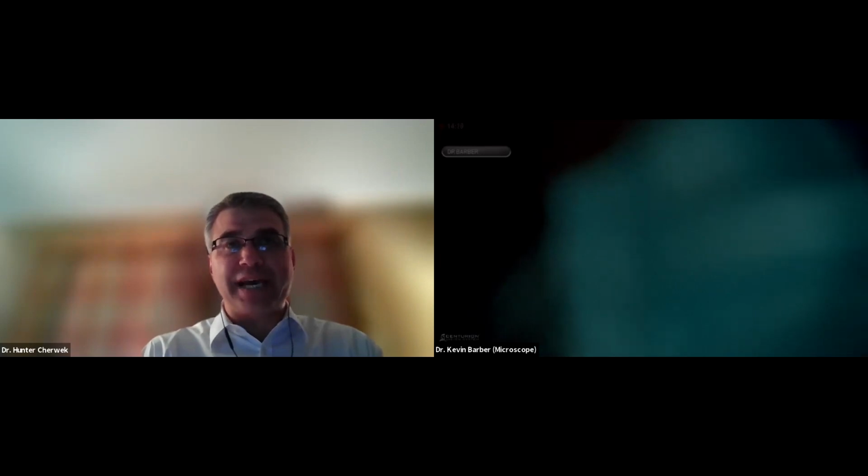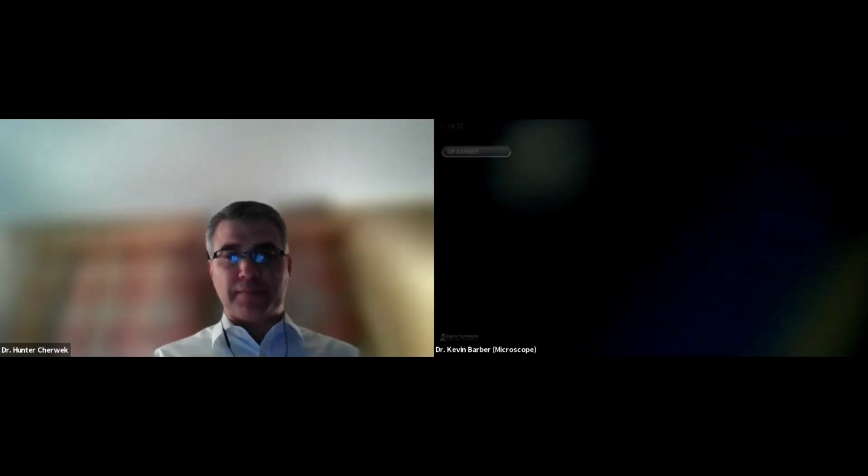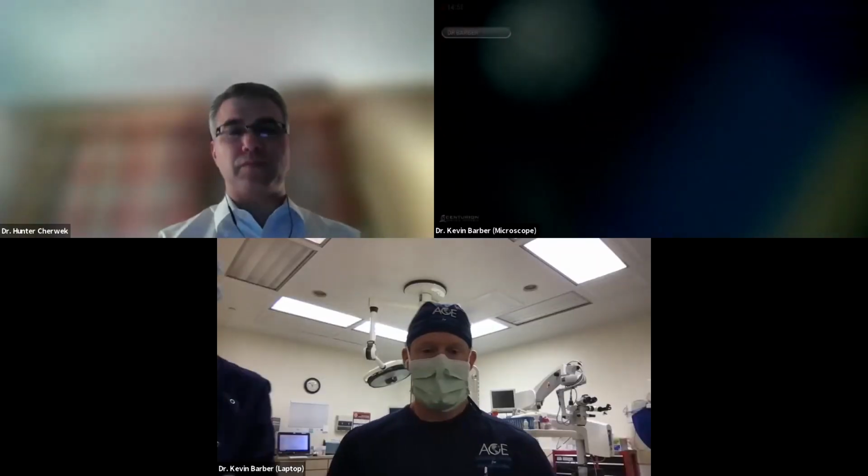So there's maximal contact between the plate and the bag so that we don't have that slippage or rotation that you talked about. I was just thinking, you really touched on something earlier, and that was really paying attention to the preoperative measurements. Those are critical. You can do the perfect surgery, but if your measurements aren't right, you're not going to achieve the refractive outcome that you want. So also learn to pay attention to things like the anterior surface of the cornea, patients with dry eye, or maybe anterior basement membrane disease. Things like that are critical.